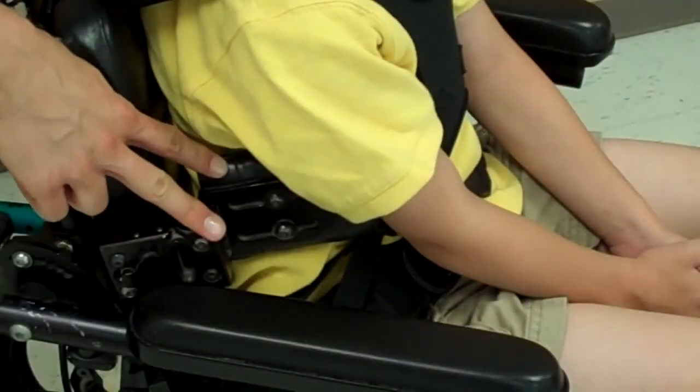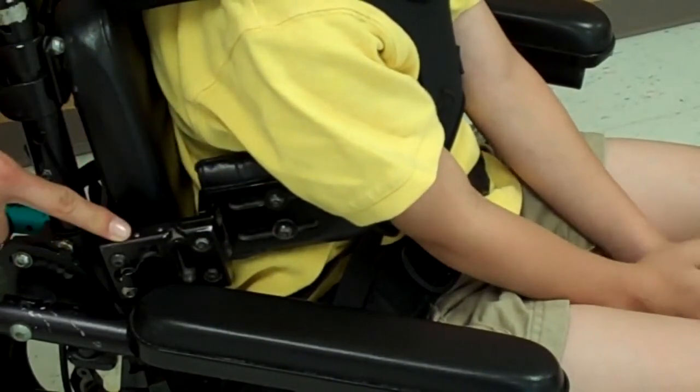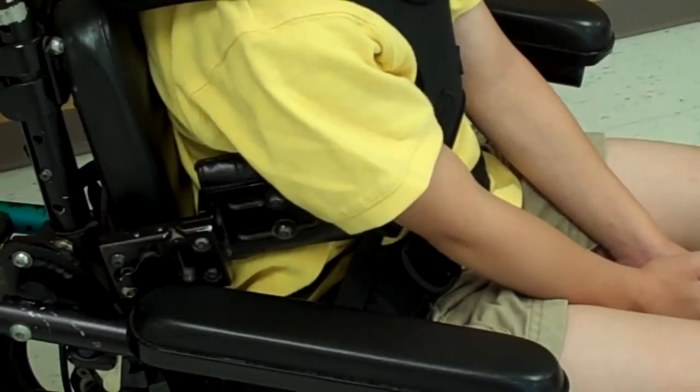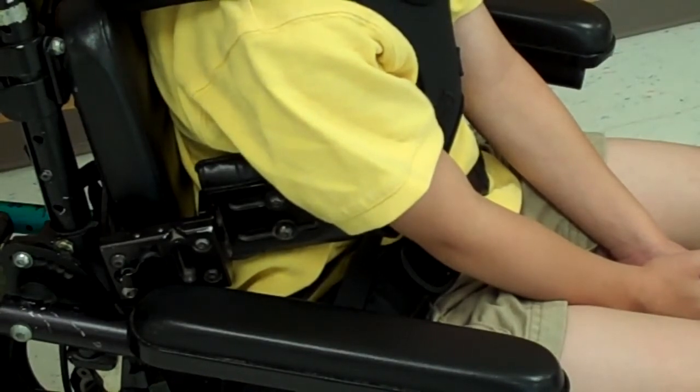Another feature that a student with decreased trunk control will have on their wheelchair are lateral supports. These give the student support on either side of their trunk. Some laterals have a swing-away option that assists with making transfers in and out of the wheelchair easier.